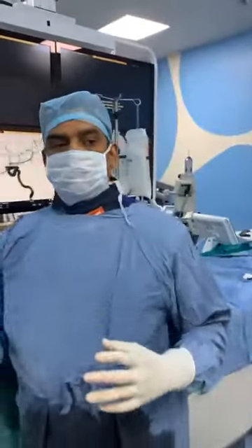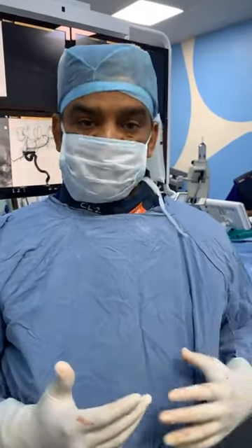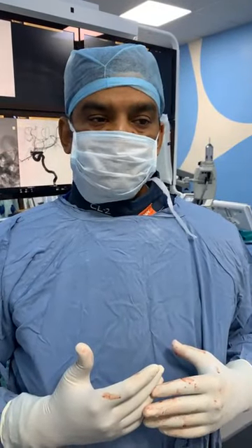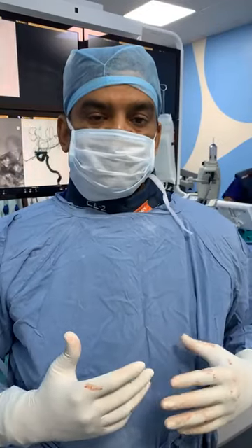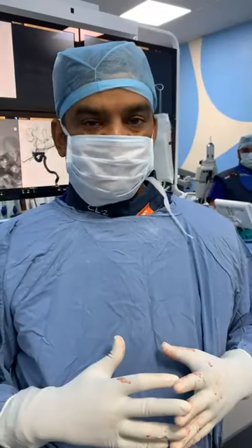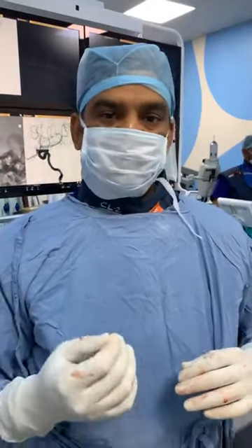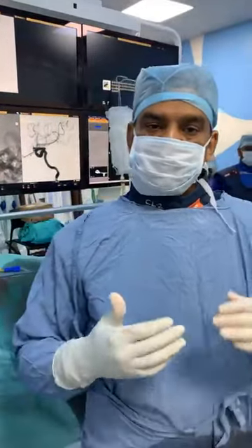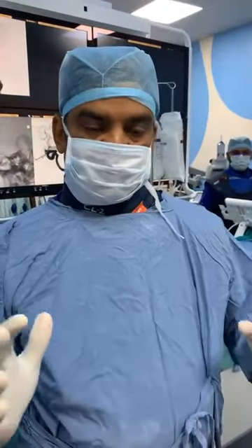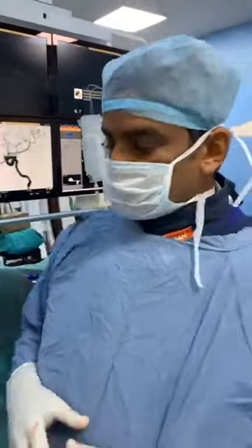So when you are deploying a flow diverter, especially in those multiple curves like S and all, you have to have patience and you have to play with the device a little bit, because it's not like a laser cut stent or a braided stent. It's like multiple wires, they are interwoven on itself. So sometimes it's challenging to open. So you just take time, play with it, push your microcatheter and then push the device and then pull back the microcatheter. Many types of maneuver you can do, and that will help us to open the stent well and oppose it to the wall. And we will see the angiogram. Hopefully we get a good result.